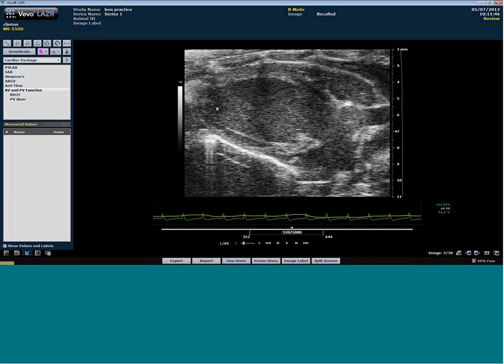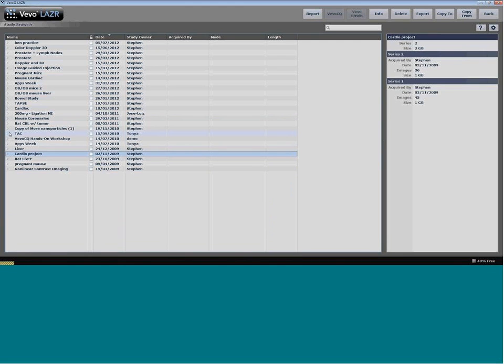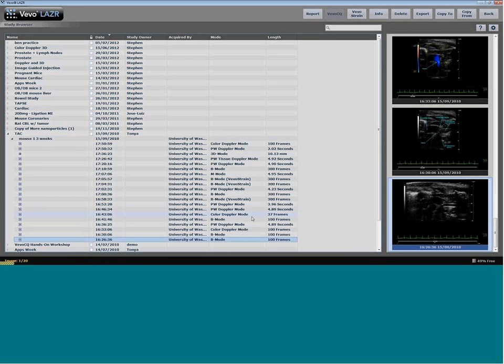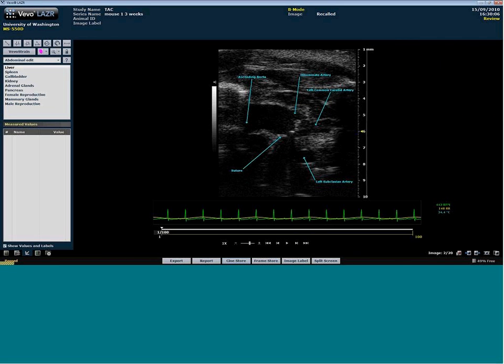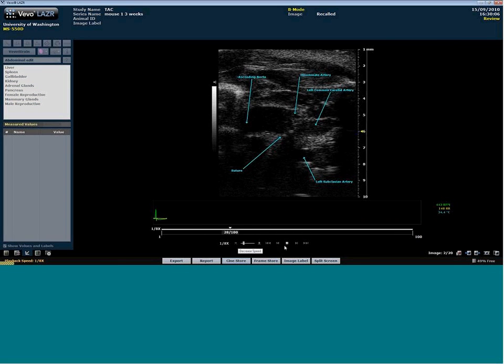We did have a few questions that came in, so maybe we can go through those. Yeah, I think Stephen touched on the first part of this question, which was about the TAC models. Maybe you could speak a little bit about TAC models, some of the challenges. Really the question is, the cross-banding pressure is very high and the flow velocity is very high. And specifically, this user was using the 770 with a lower frequency transducer, the 710B, which is a 25 megahertz transducer. As a result, they can see much higher velocities.